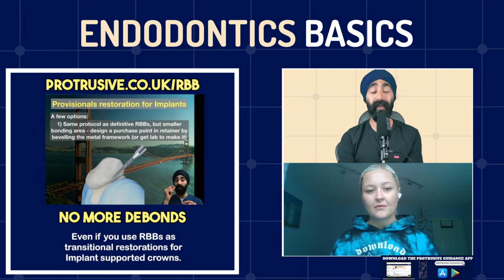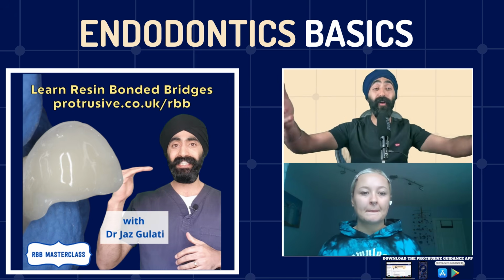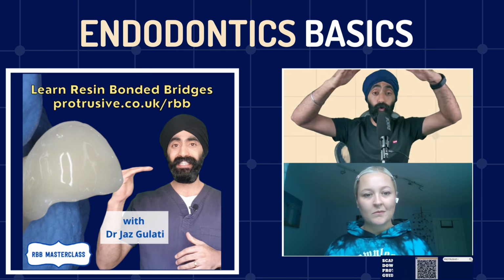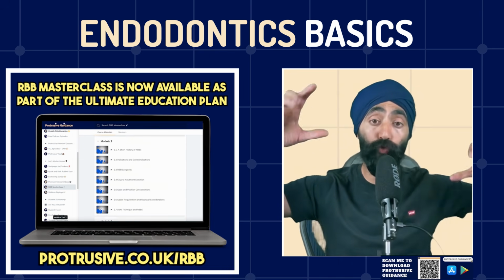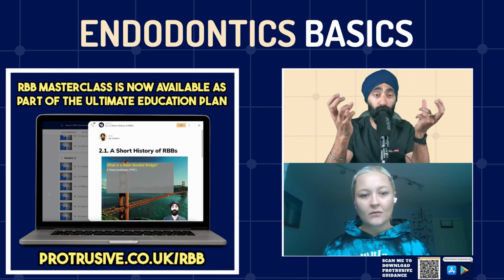And at that point, you can actually bring the cusp down and then overlay. Now you have a direct cuspal coverage, right? But from your composite, you've now also built a coronal seal. You've got rid of the old tooth structure, and you've made those cusps shorter and fatter, which means less flexing, and made it stronger.